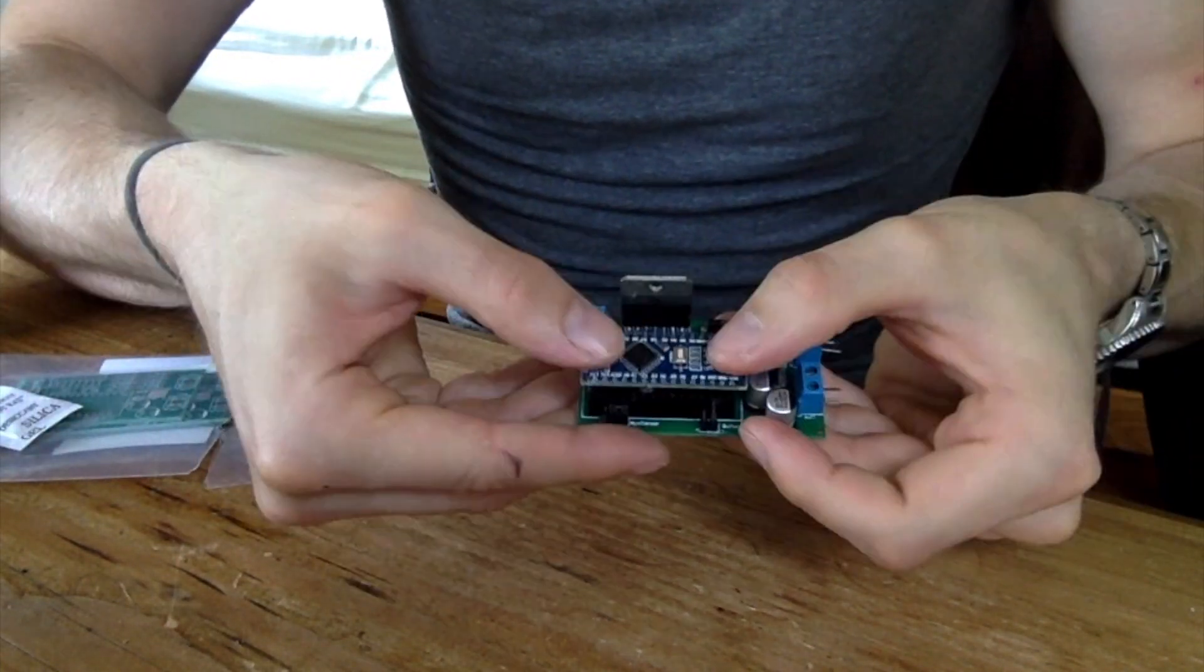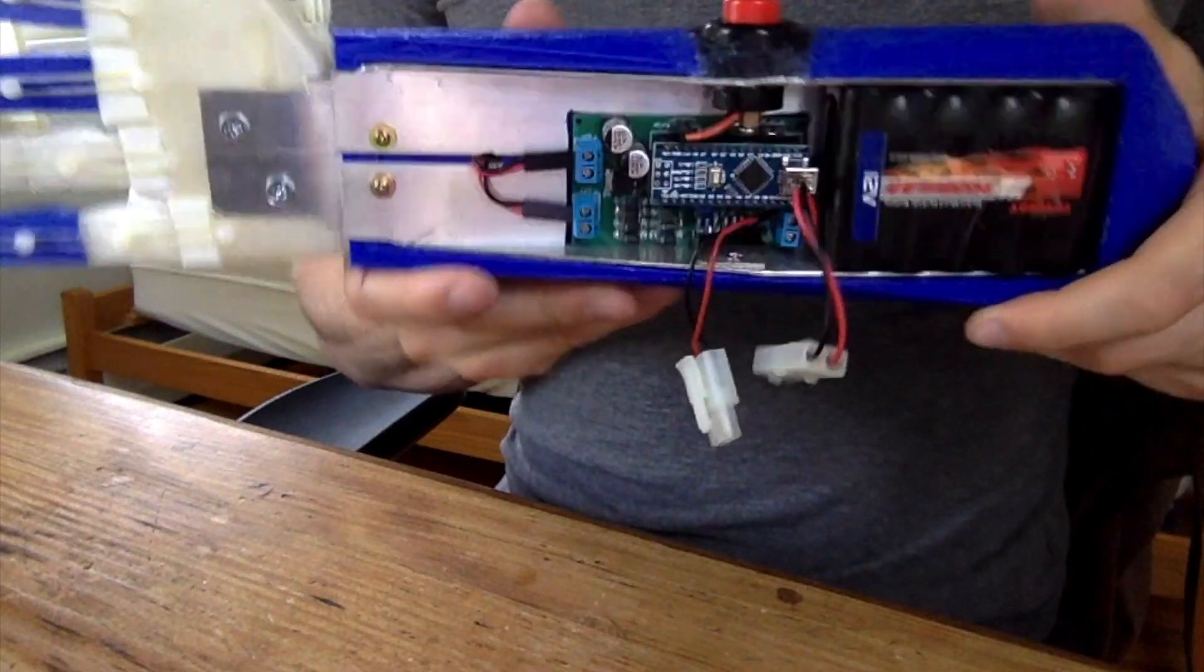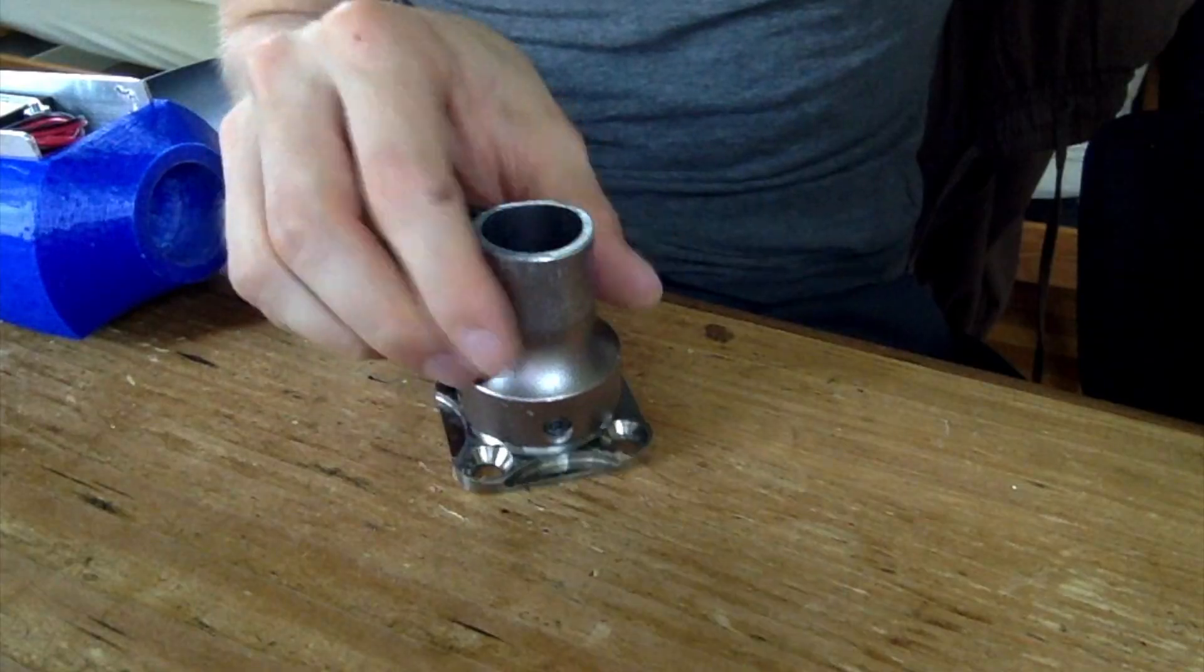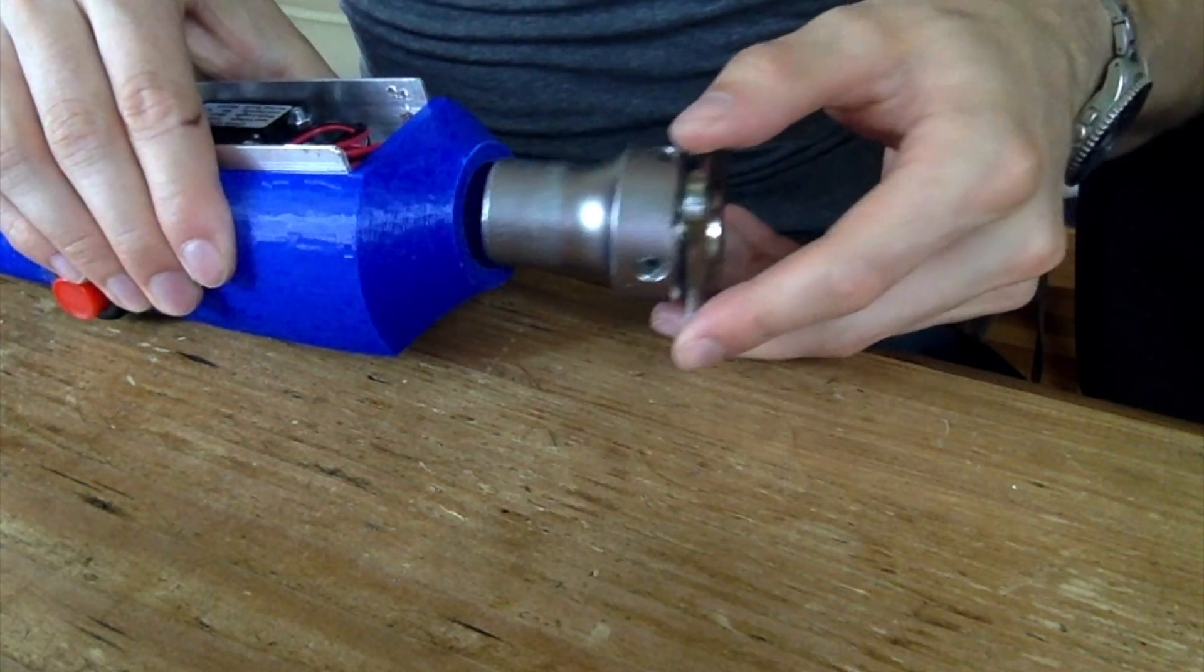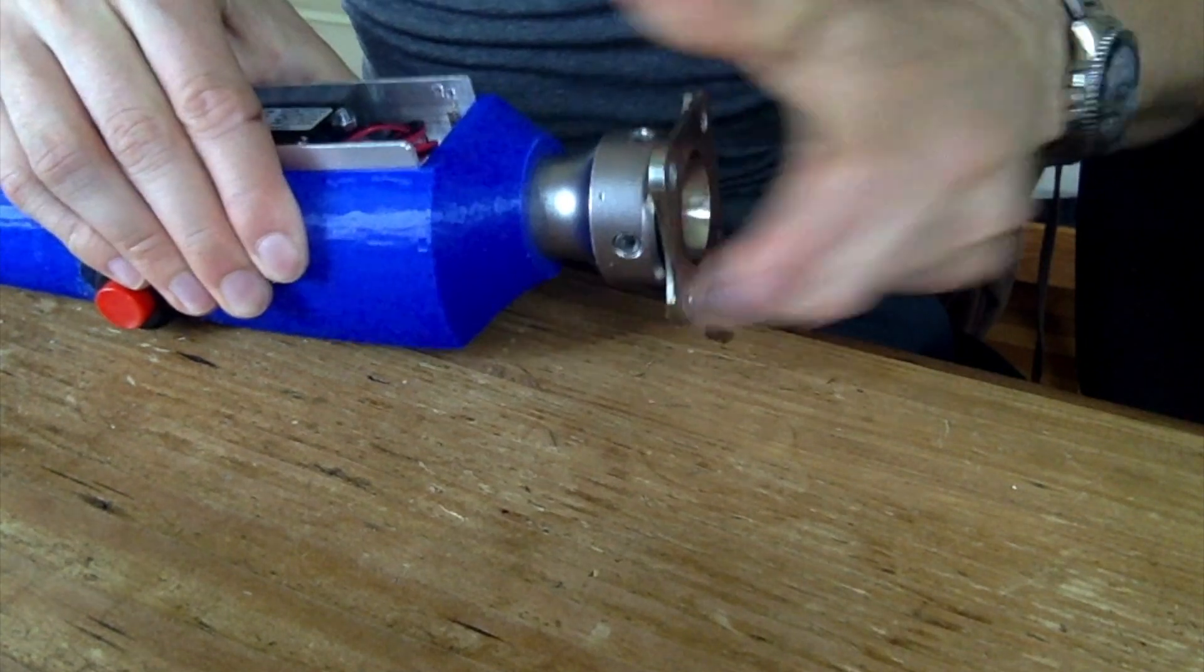The Arduino Nano fits right into place, and the whole circuit is screwed onto the housing. Finally, I add the prosthesis adapter onto the back of the housing. I'll fix this more permanently once we have a more complete version.